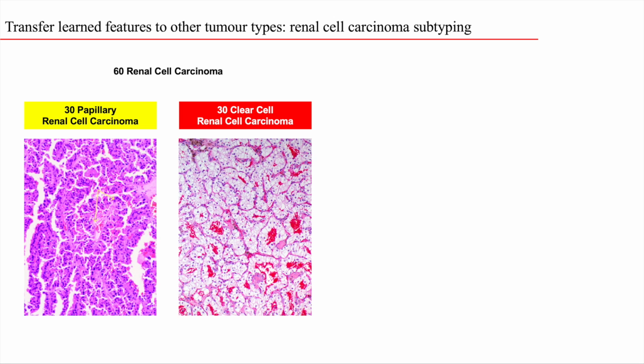And here we're trying to really create generalizable tools that can be applied to other types of tumors without the need to recreate millions of images and train these neural networks, because this process can in fact be quite cumbersome. So we wanted to see if we can carry out some intelligent tasks outside of our field using these neural networks that have been educated on a diverse array of features across brain tumors.